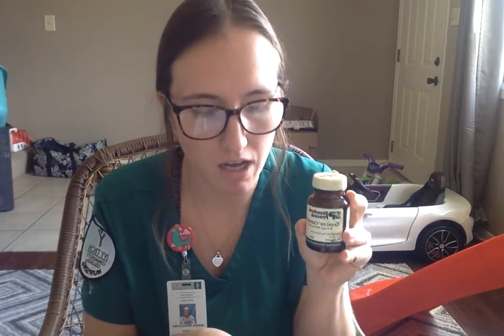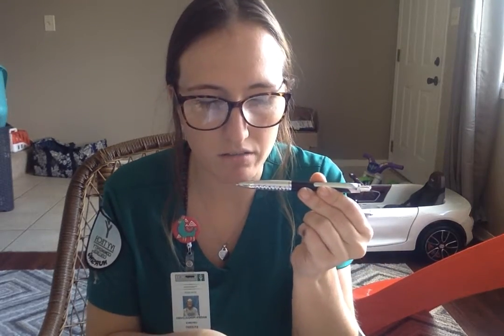Okay, so I am going to wash my hands before I prepare my medication. Wash my hands. Okay, now the first thing I am going to be preparing is my Humalog, which is going to be my insulin. It's also my subcutaneous injection. So with a subcutaneous injection, the size that you want for everything is a 28 to 31 gauge with a 0.3, 0.5, or 1 milliliter syringe. So it's pretty small.